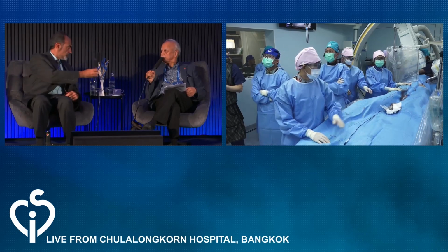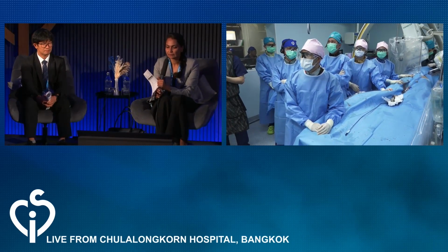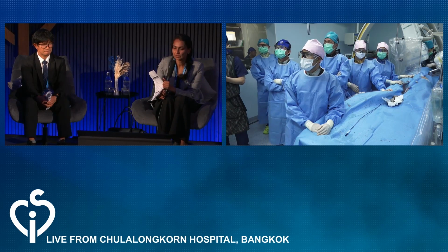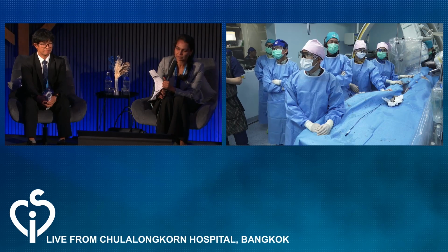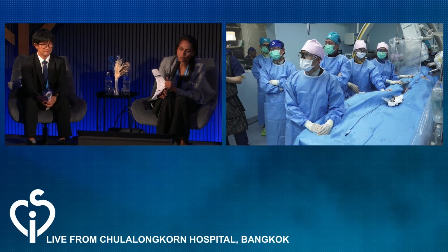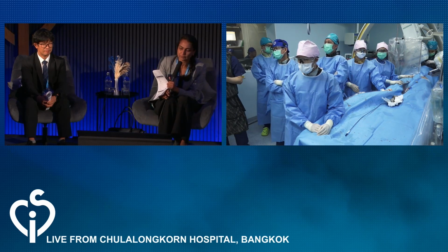Right, Shabana? Yeah, I would agree with closing it. I truly don't understand the ventricular dysfunction. I'm not sure this is causative. It probably increases PA pressures a little bit, but not the wedge pressure by itself. I would actually choose an ADO1 for this. It's a single hole, so I think an ADO1 is well suited for this kind of anatomy.